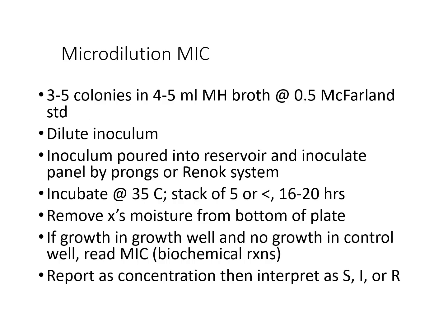For the inoculum preparation, you're going to use 3 to 5 bacterial colonies suspended in 4 to 5 milliliters of Mueller-Hinton broth to achieve a 0.5 McFarland standard turbidity. You're going to dilute this inoculum as required for the test system. For the inoculation, pour the inoculum into the reservoir. Use a multi-prong inoculator or automated system like a Rinoc to inoculate the antimicrobial panel wells. For the incubation, you're going to incubate the panels at 35 degrees Celsius and stack no more than 5 plates. For incubation time, it's going to sit for about 16 to 20 hours.